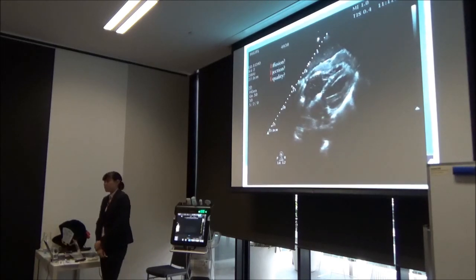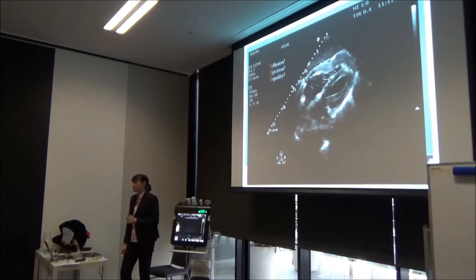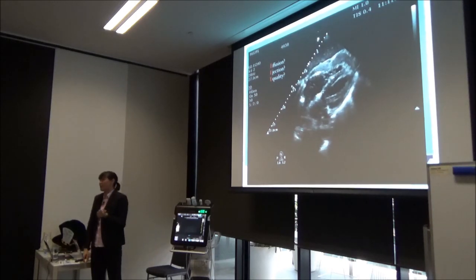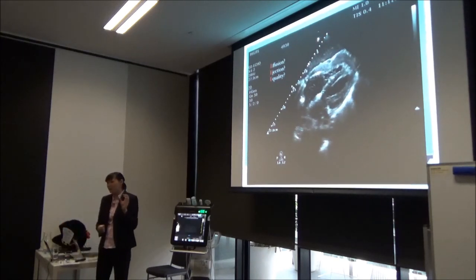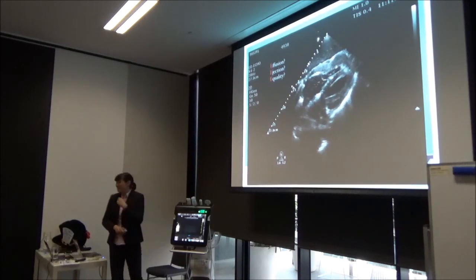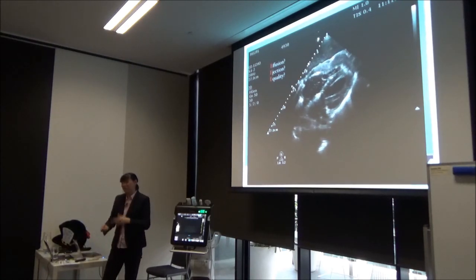First pulse check. 5 E's. Do I have an effusion? Yes. Majority say yes. Is it small or big? Big. Okay. And what other properties does it have? Is it fresh or clotted? So it's clotted. Okay. So now we have dry blood in here. That's not good. Ejection? Okay. That's a gimme. Equality? Fine. Okay.